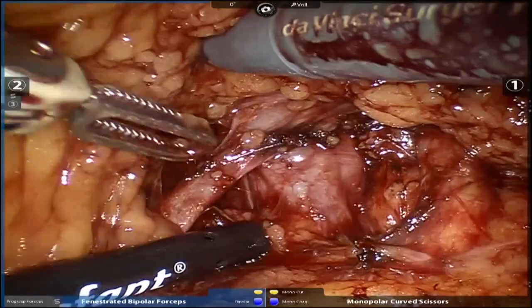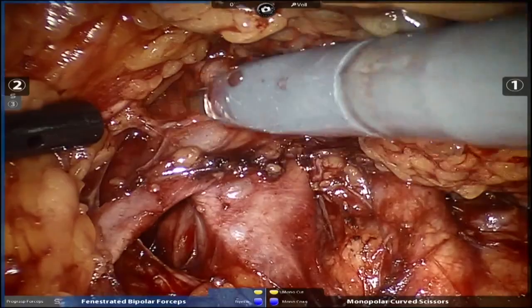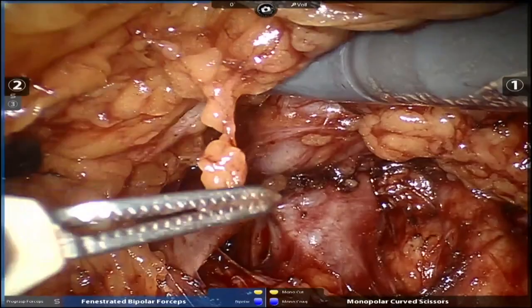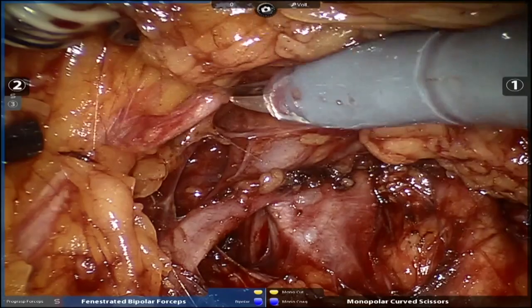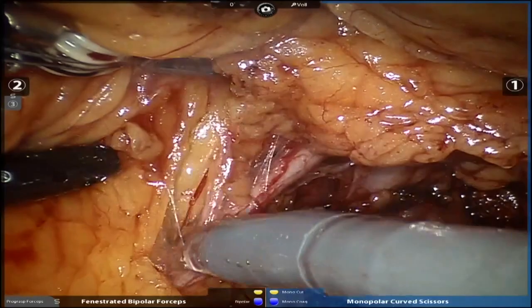Okay, so we have the vein if we need it. We may not need it, but we have the vein if we need it. And now let's go up here and look at this artery branch up here. This might be a branch off the main artery, but there was also suggestion of another artery. So right here, you see there's another vessel right here, okay? And again, I'm looking at this because I have an idea already in my mind that there are extra vessels here. That's another vessel here. That could be ureter, possibly. But there's another lower pole vessel we saw in the imaging that has got us intrigued that I'm going to keep looking for.